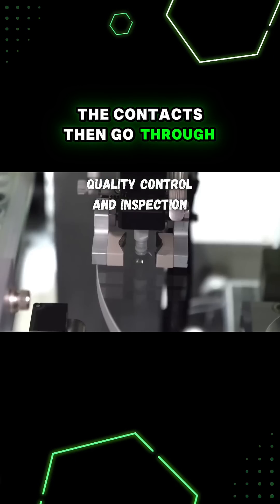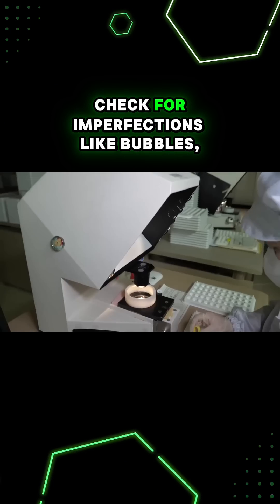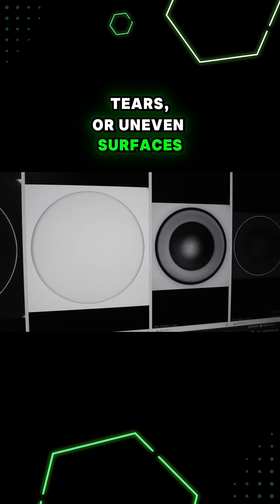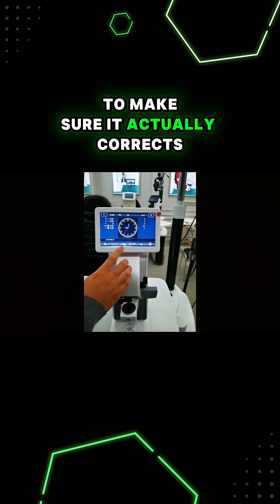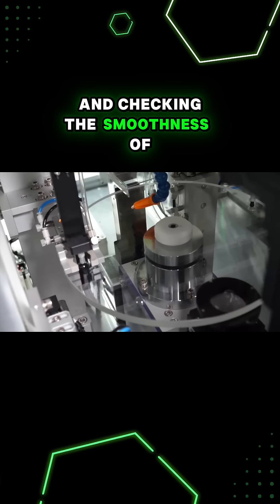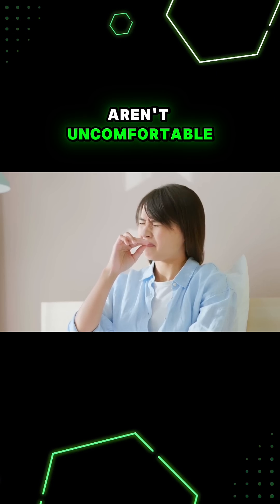The contacts then go through quality control, where microscopes are used to check for imperfections like bubbles, tears, or uneven surfaces. Each lens is measured for the correct curvature and power to make sure it actually corrects for the vision errors that it's supposed to. Checking the smoothness of edges is really important to make sure that the lenses aren't uncomfortable.